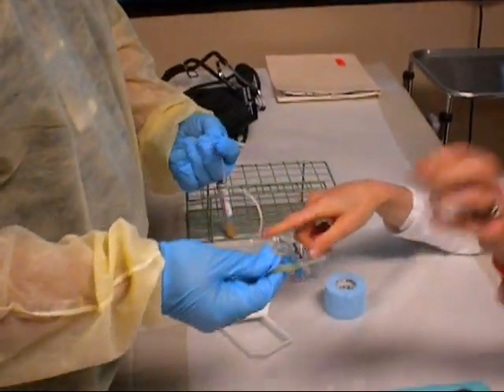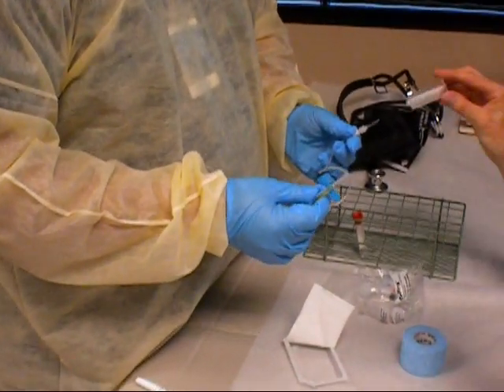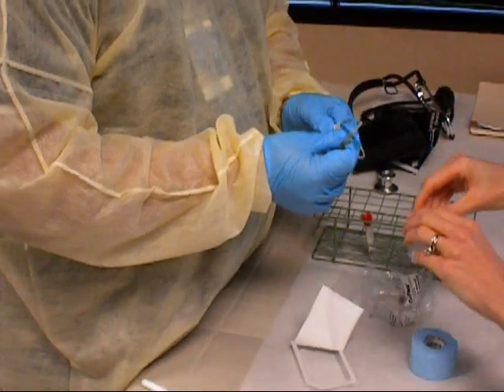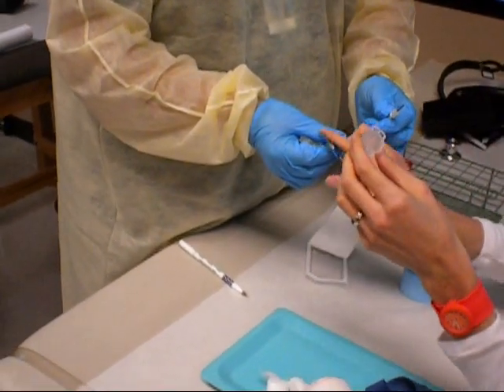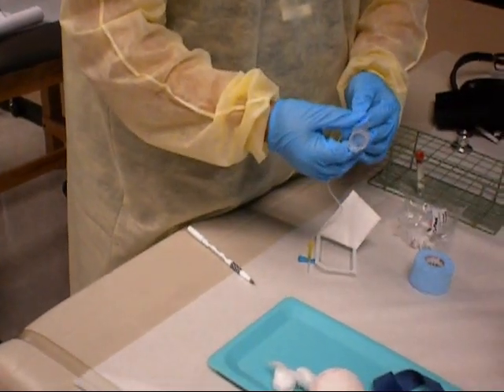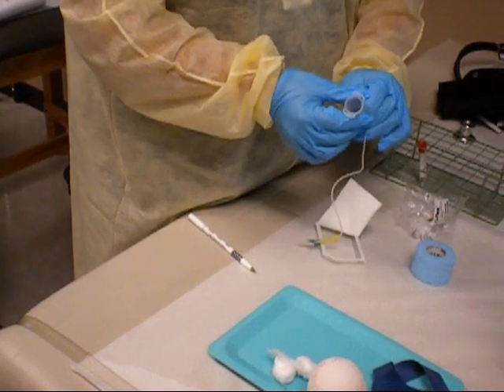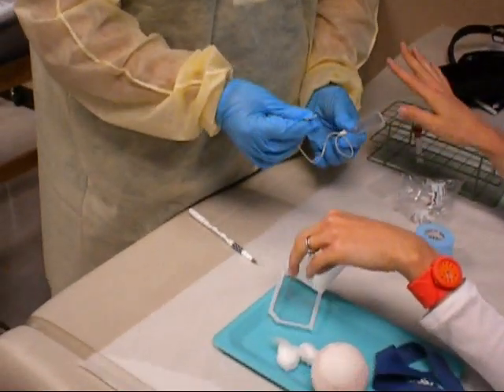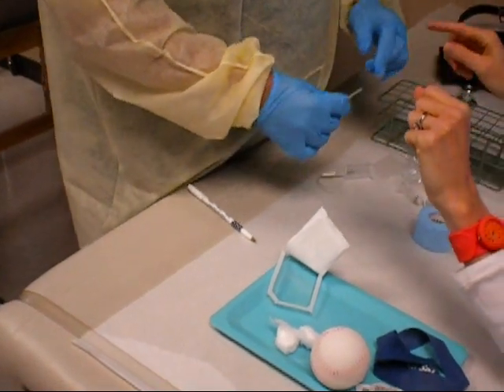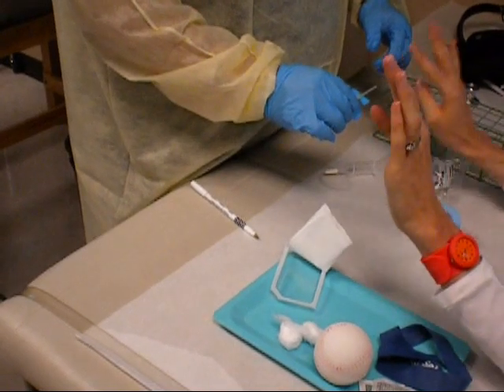We're going to take that gray in. You're going to screw it on. This is a gray — I've got to take off the gray. So you're going to just put this down, take that and screw it. There you go. So that is your needle, and you're just going to get your tube. The shield is on right now.